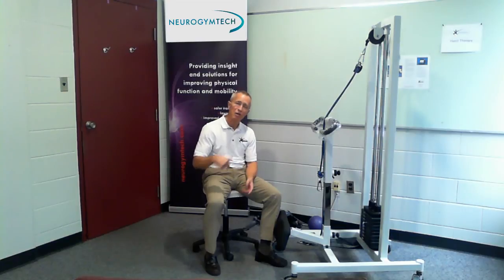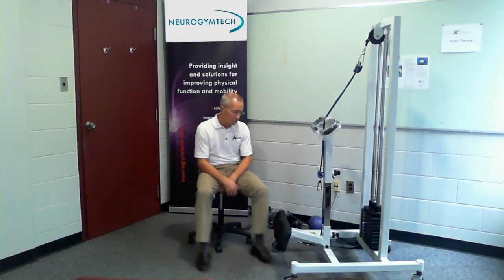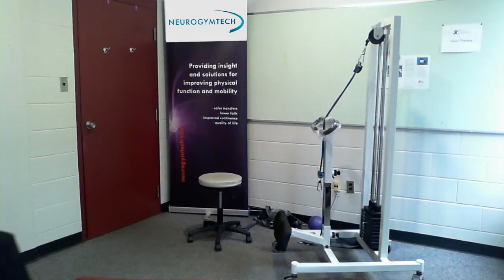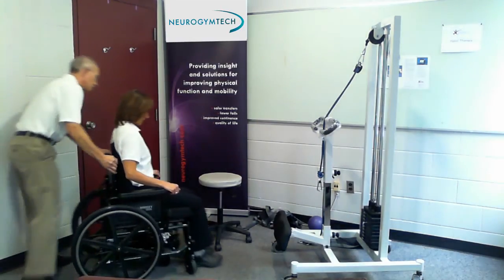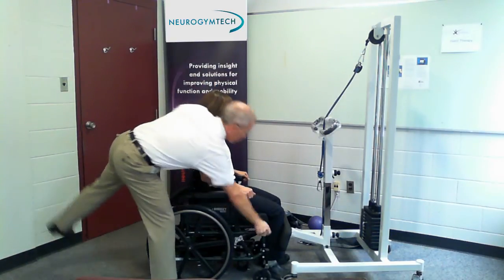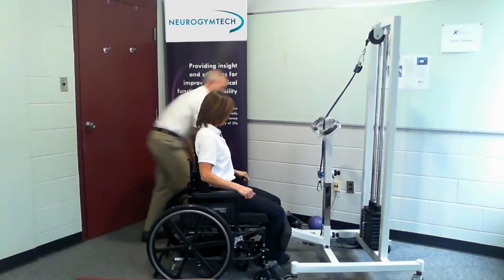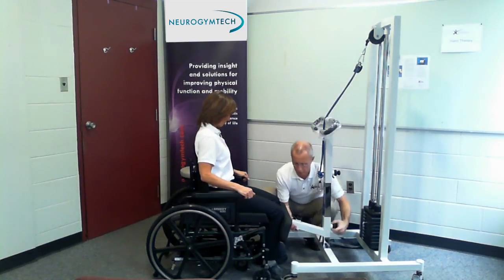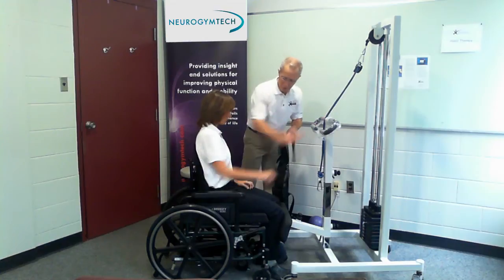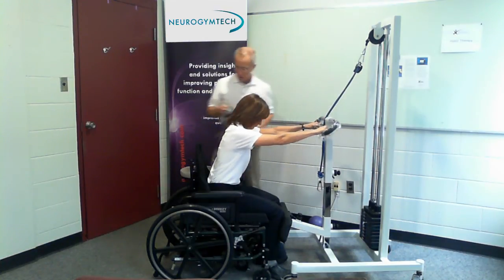The best way for you to learn is to have somebody being a patient and somebody being a clinician in your sit-to-stand trainer, and run through each of these applications, then change it up after each one. So I'm going to bring the patient in and lock the wheels. Then I'm going to take the sling and ask you to put your hands up here if you can. We'll talk about arms later.